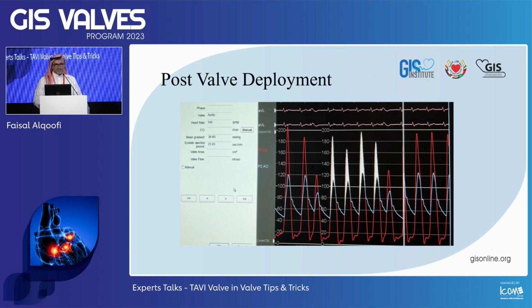But think of under expansion of the valve, the folding. The folding still is very high for this diameter. So that's a very important point and an excellent point. The mechanism behind the higher gradient could still be 2: either we have a small valve or the leaflet is pinned.